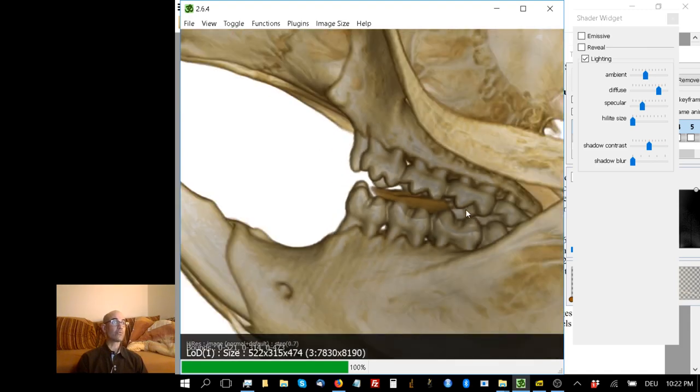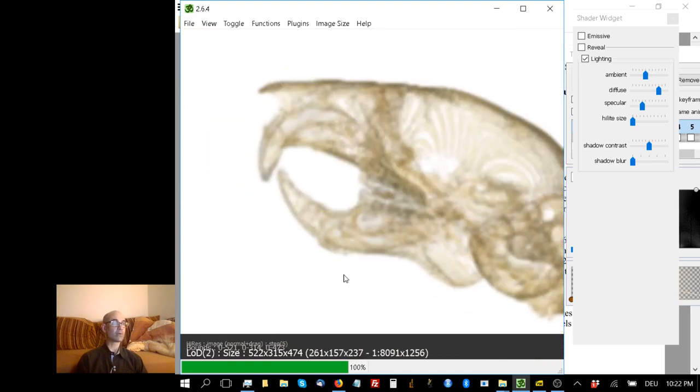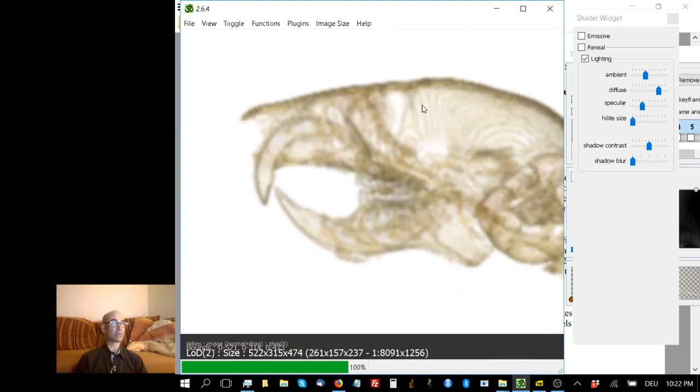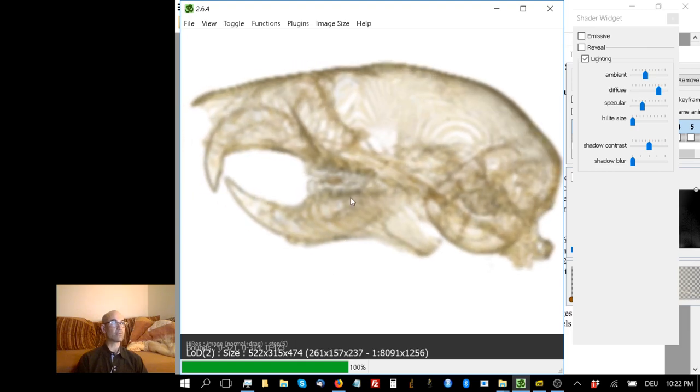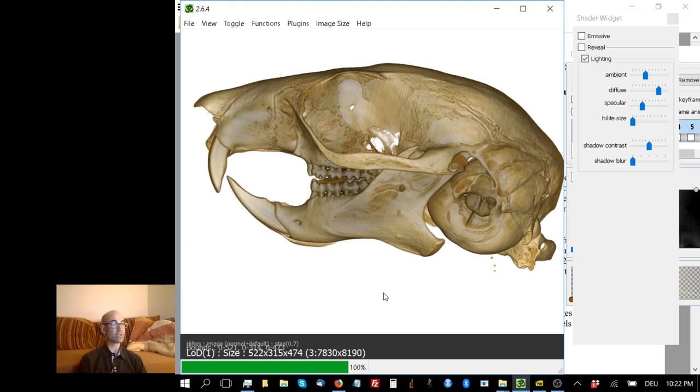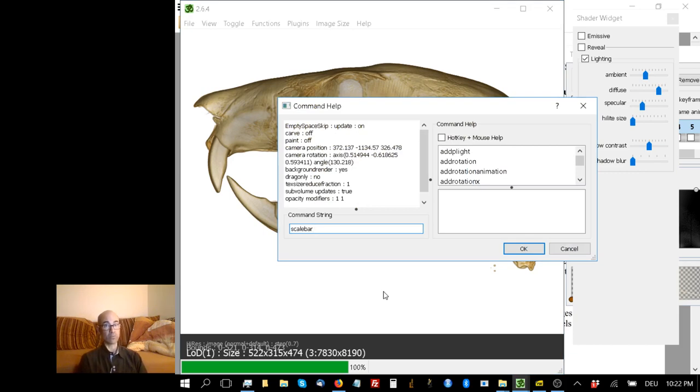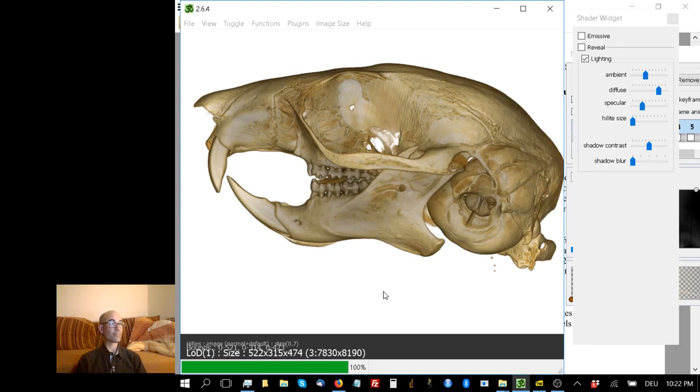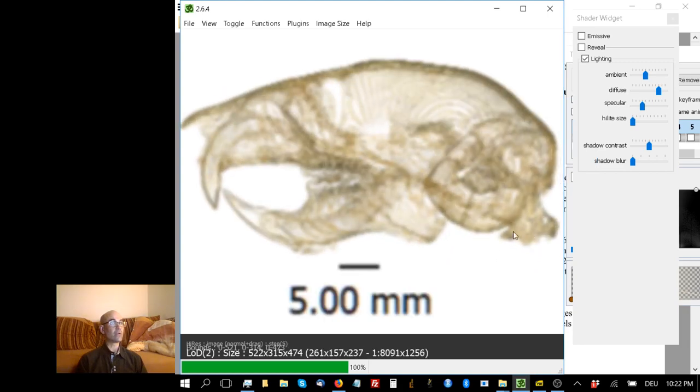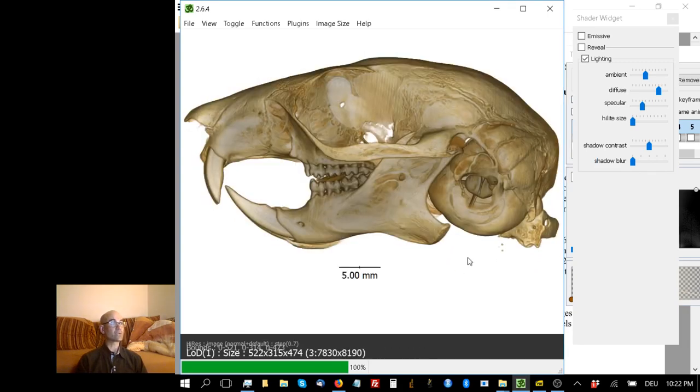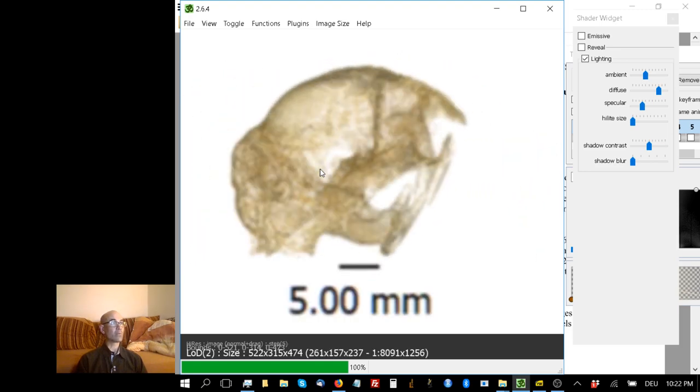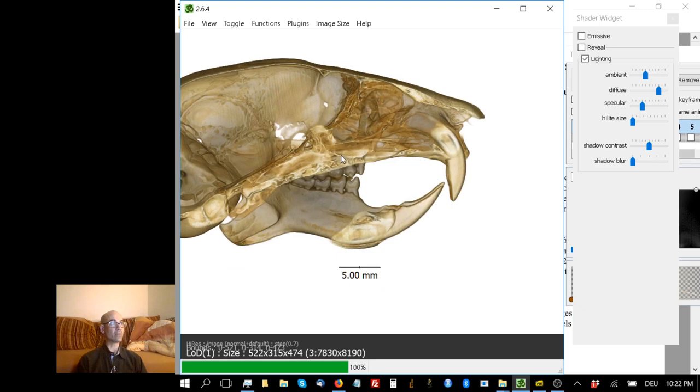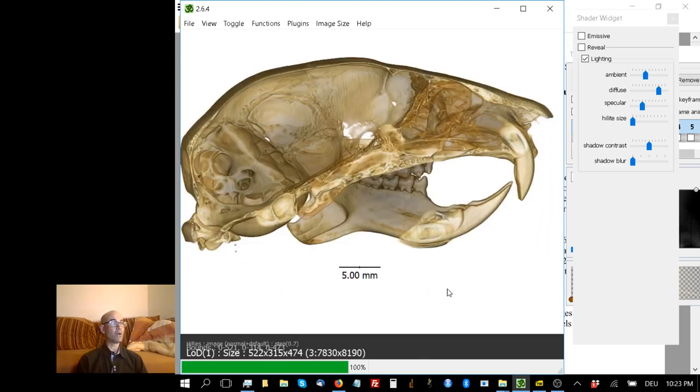If for taking figures, maybe I want a scale bar. I'll put my skull in an orientation that will be visible. I hit space bar, making sure the mouse pointer is in this 3D window region. I type scale bar. You have to tell it how many units. The units are already there from when I entered the voxel size. I told it millimeters. I'm going to use a five millimeter scale bar. There it is. You can hover over that scale bar and drag it around. You get a nice 3D reconstruction that you can rotate. You can look inside the skull by going back into low-res mode and moving your anchor points appropriately. I think I'll stop now and hope to see you again sometime soon.